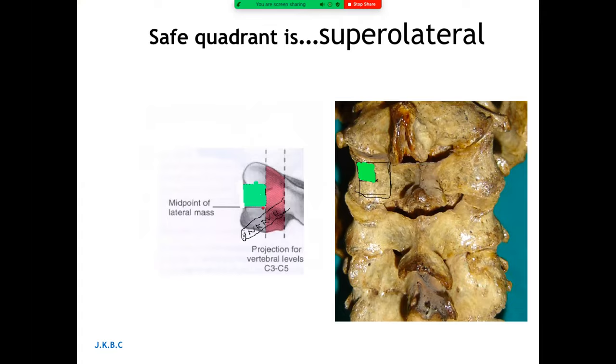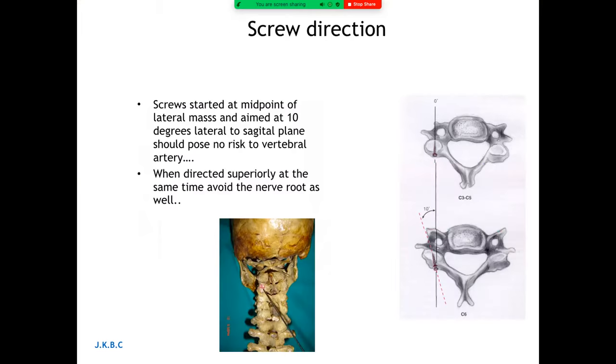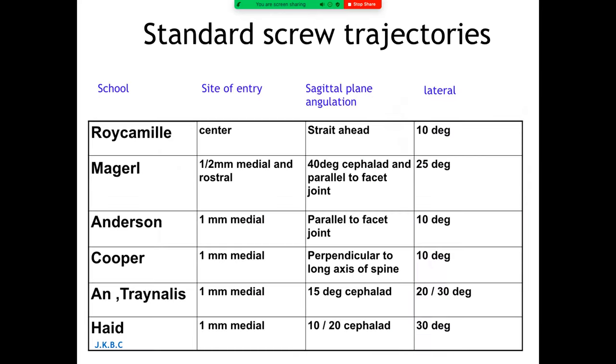Very easy, very simple for all the students to appreciate this, to do the posterior lateral mass screw fixation. So any screw that is inserted from the center of the lateral mass and directed laterally and also superiorly should be safe enough. I would like to show the video on this, but there is always a question then: who started and how it has gone through.